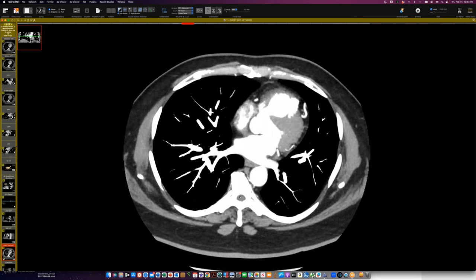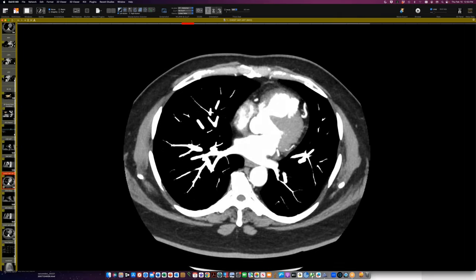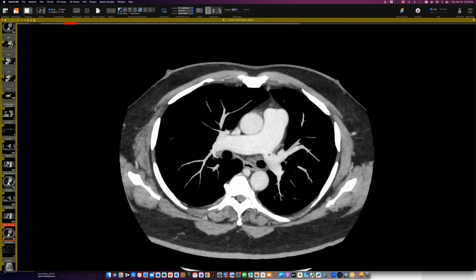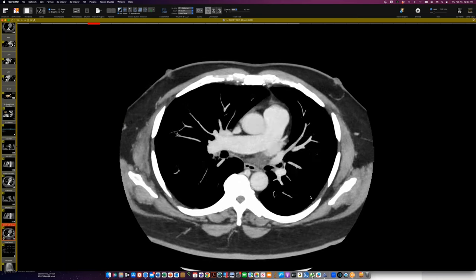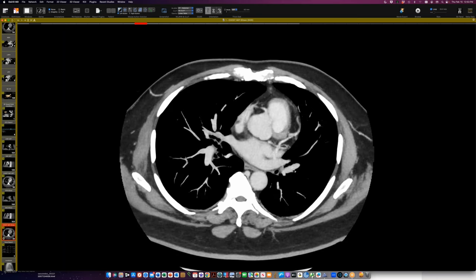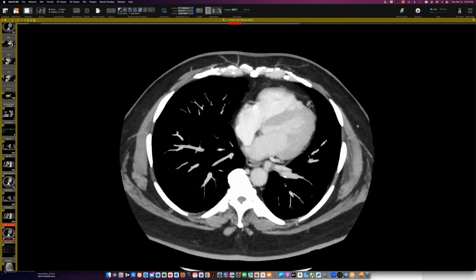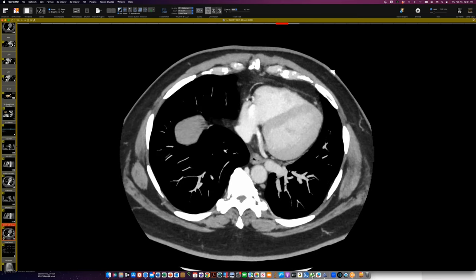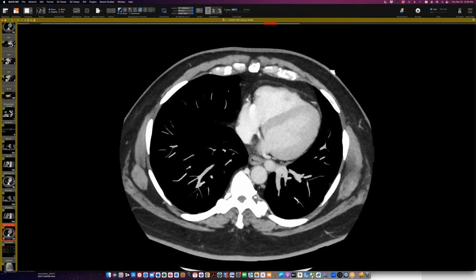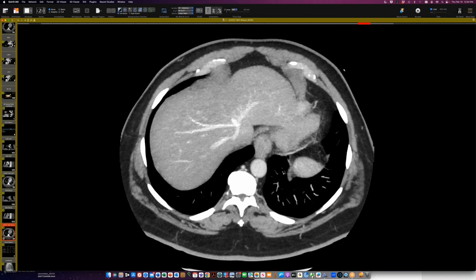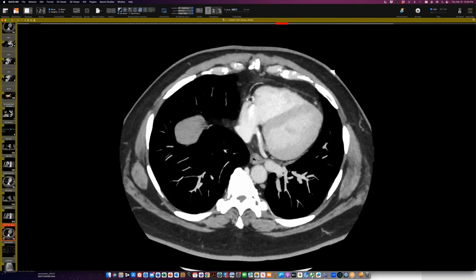On the coronal view, you can see this vessel is a little tortuous in its takeoff but basically replaces the pulmonary artery in the left base. Going back to cross-section, that left base looks hyperemic because it's being bathed with systemic pressures compared to vessels on the other side — the vessels are fatter. What I didn't realize when I showed this case before is that this systemic artery is actually replacing, not just supplementing, the normal pulmonary artery perfusion to that lower lobe.